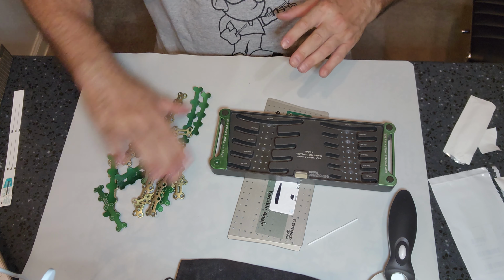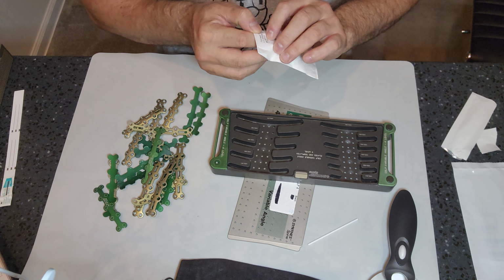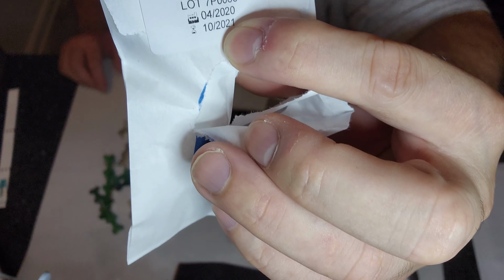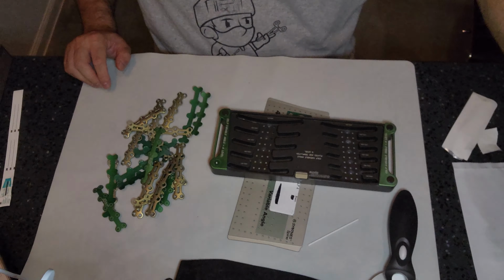Now, let's assume we're going to let that do its thing, and honestly, it's not going to do anything because that package is expired, guys. Okay, it's not going to do anything. It's going to give me a false reading. It's going to give me a false positive or a false negative, but that's expired.